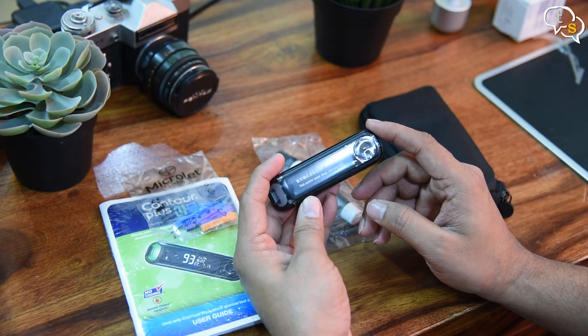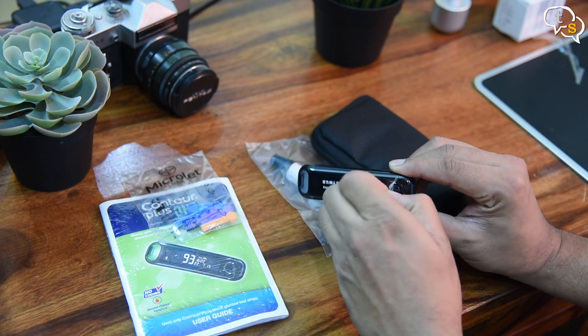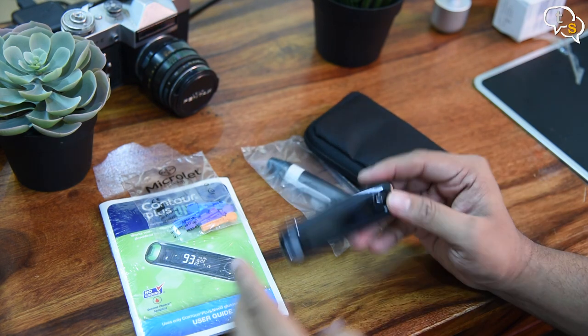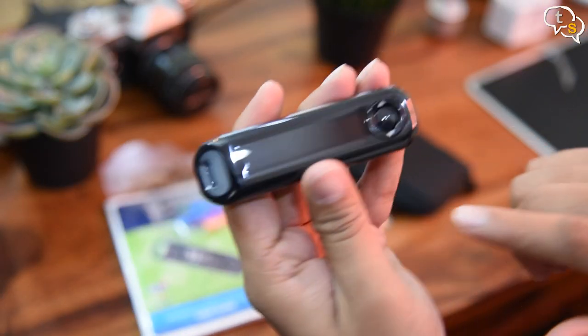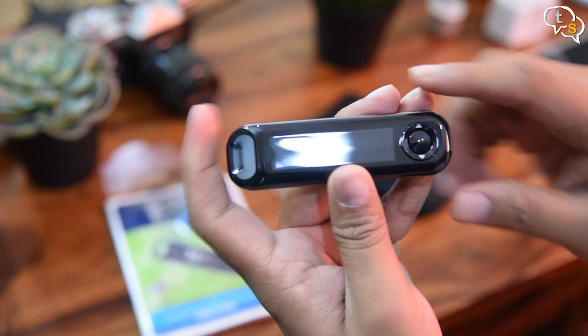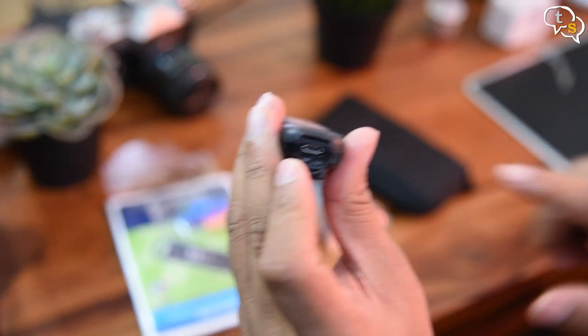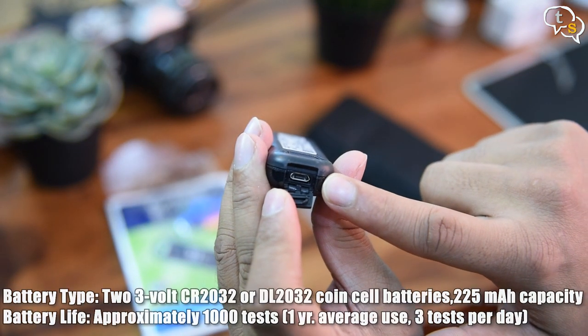This is the main device. It is quite small with an LCD display covering most of its face. On the left is where we would insert the test strips. Then we have the main display where the readings would be displayed, and up, down and center buttons to navigate the menus and settings, and a micro USB charging port on the right.